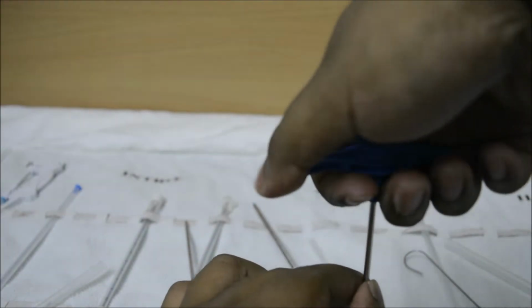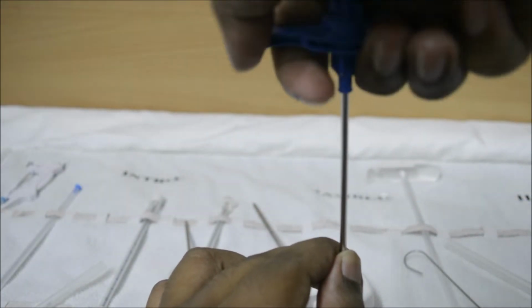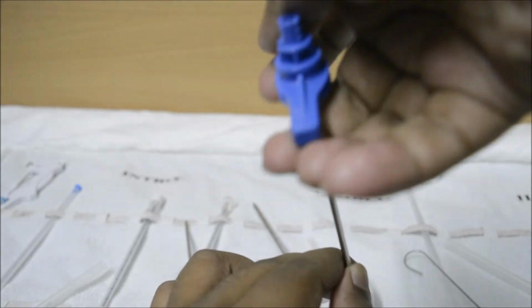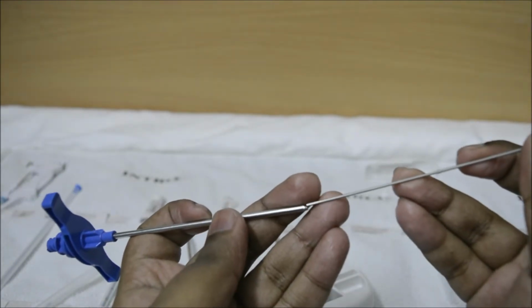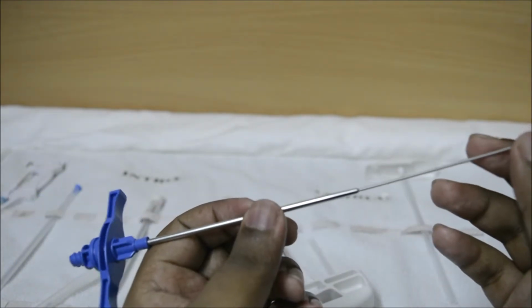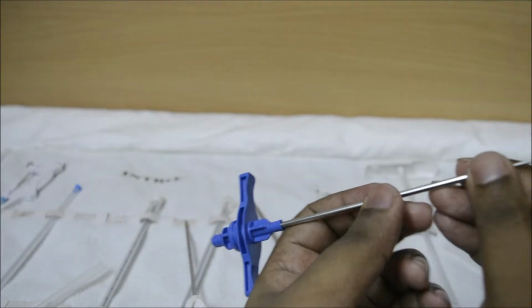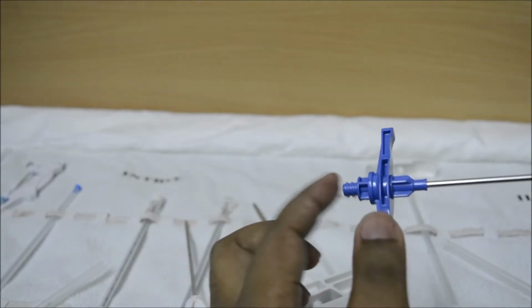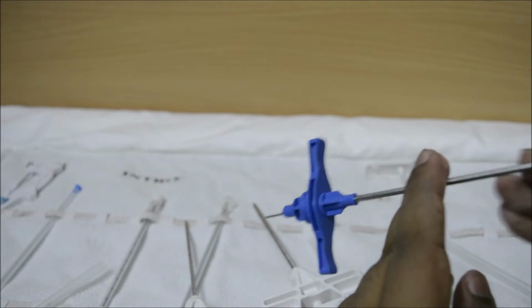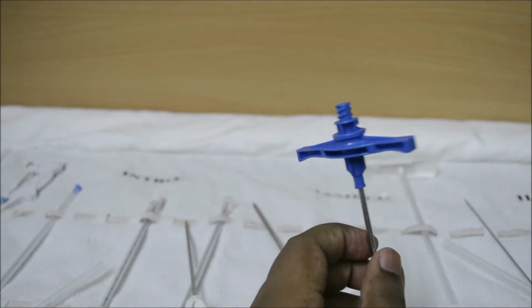Now the needle is pulled out of the patient's body, again performing 180 degrees right and left. Once it is out, this specimen collector is inserted from the tip of the needle, and as it is inserted, it gives a gentle push, and then the specimen is pushed out from this part of the needle into the specimen collecting tube. So this is how solid bone marrow tissue is collected.